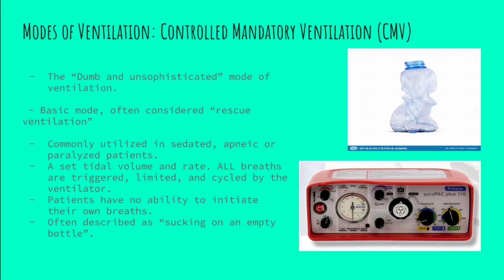So what controlled mandatory ventilation is, it's a mode of ventilation that does not recognize any breaths that are triggered by the patient. It focuses on a set tidal volume and a set rate. So we're setting that minute volume, and that's what the ventilator is going to deliver. All breaths are triggered, limited, and cycled by the ventilator, so the patient has no ability to initiate their own breath. This is often described by patients who have been under sedated or required paralysis, that when they were trying to breathe, it was like sucking on an empty bottle.